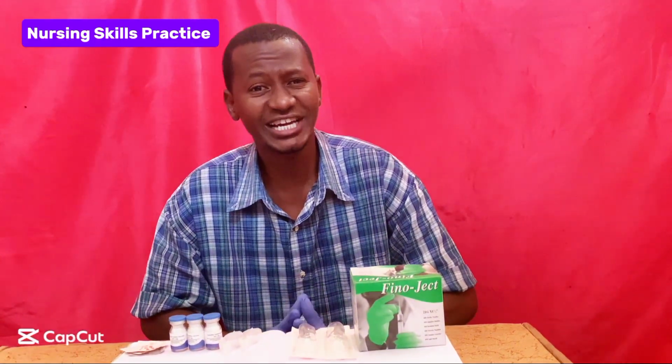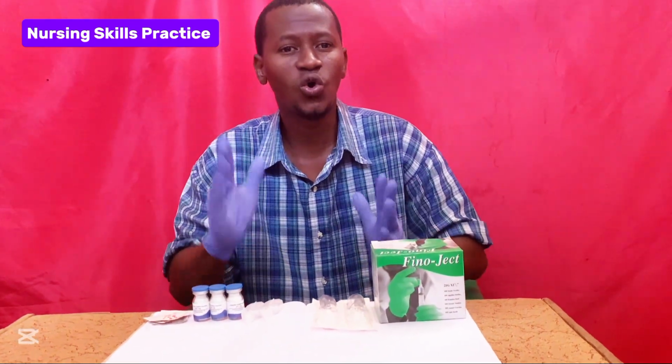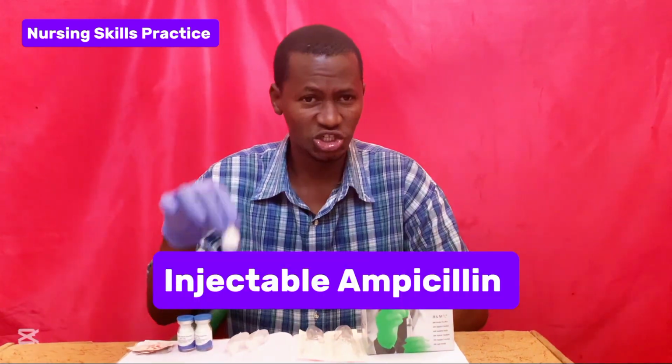Hi everyone, welcome back. In today's video, in this tutorial I am going to show you how you can simply dilute or reconstitute ampicillin injection. So in this video I am going to show you how you can simply prepare ampicillin for injection.